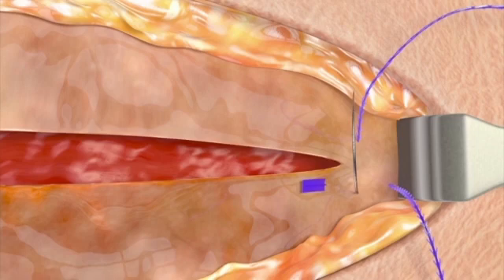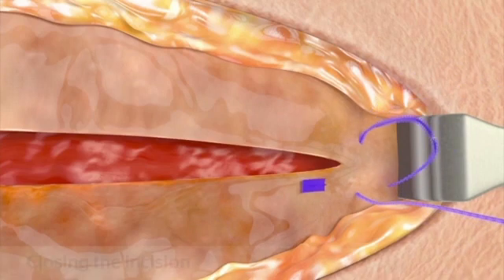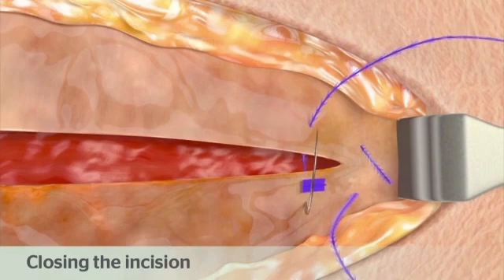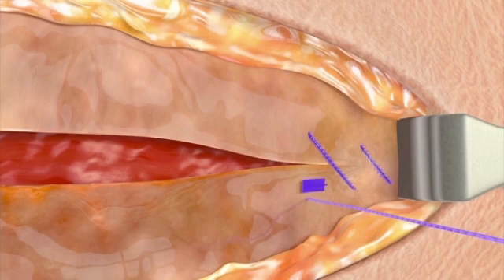Proceed with a continuous suturing pattern to close the incision, taking opposing bites on either side of the wound in standard fashion. To achieve the desired approximation and tension, gently pull on the device with each tissue passage.